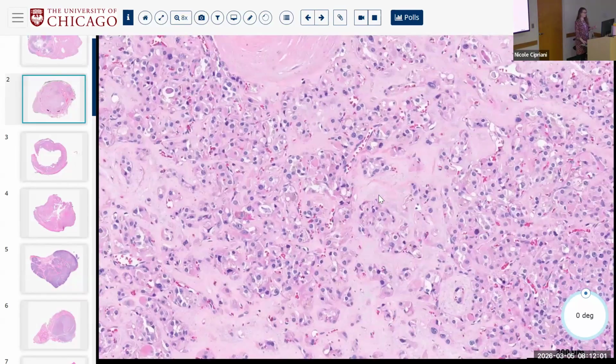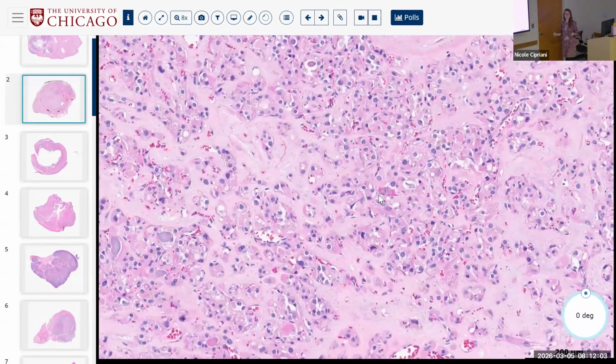So remember that oncocytic thyroid neoplasms are a separate category from follicular neoplasms, because they are genetically different. What's the genetics of oncocytic things compared to follicular things? It's mitochondrial DNA mutations. What else? Gains and losses, copy number alterations, right? As opposed to the non-oncocytic follicular pattern neoplasms, which we were dealing with in the slide before.